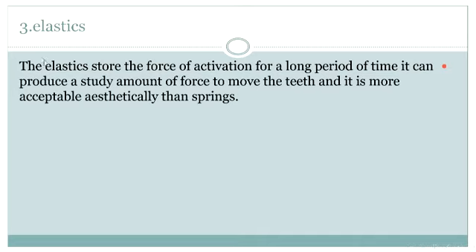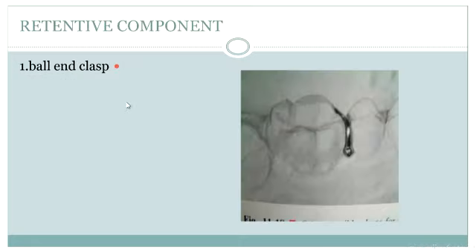Third part of the active component of the removable appliance, elastics. Elastics store the force of activation for a long period of time. They can produce a steady amount of force to move the teeth, and they are more acceptable aesthetically than springs.